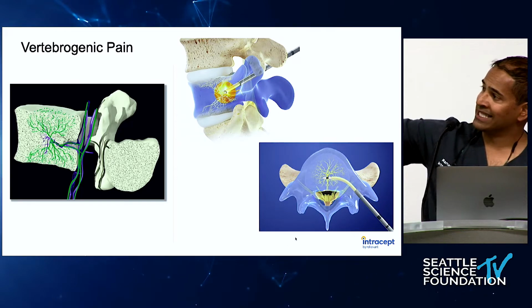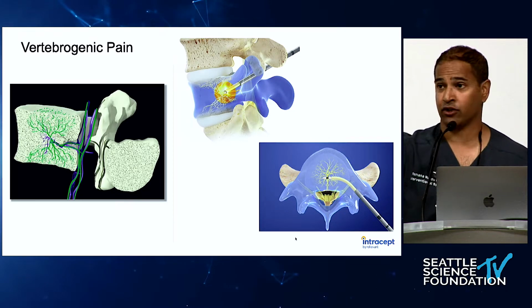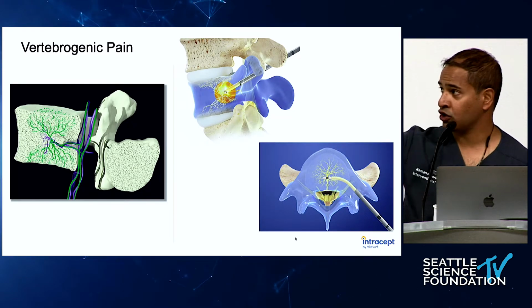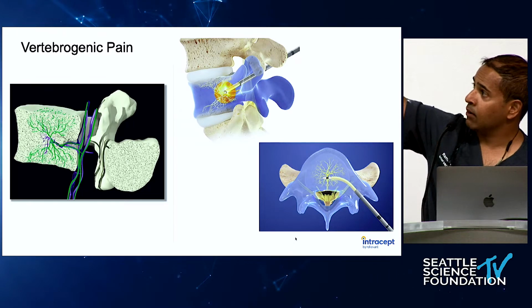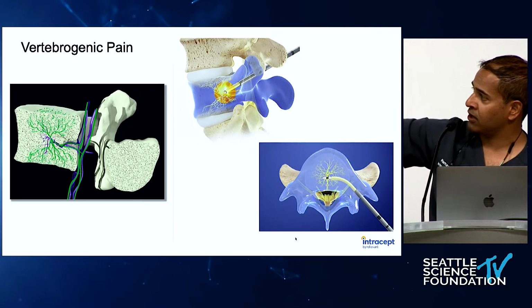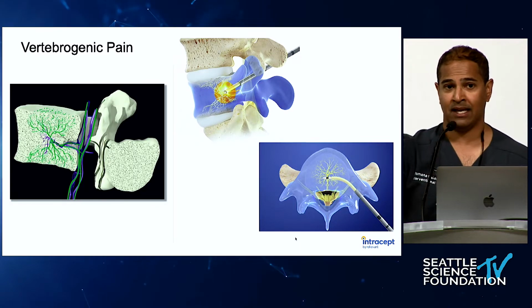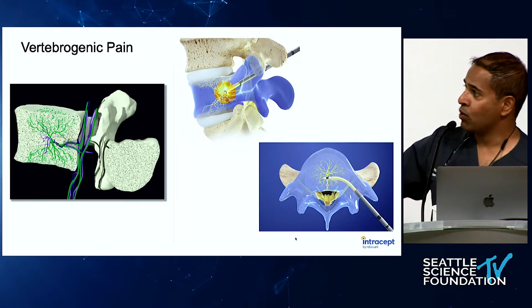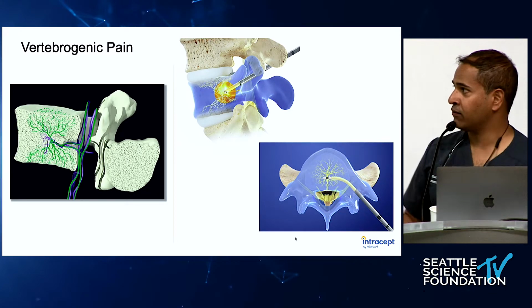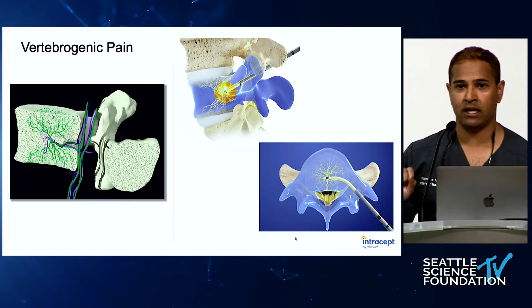The nerve itself sits inside the vertebral body. It's associated, like any nerve, with vascular structures. So there's arterial venular structures that coincide. You can see it on MR, T2 sequence. And what you're seeing here on the top and bottom here is a procedure. So basically, it's taking advantage of two therapies in kyphoplasty, which got us doing pedicle access, with radiofrequency ablation, which you heard about from Dr. Phillips this morning, taking those two concepts, ablating that nerve.